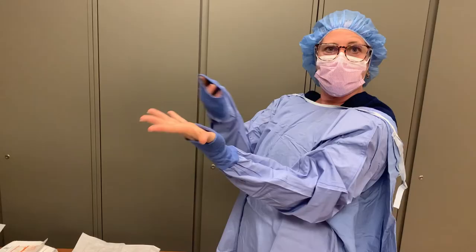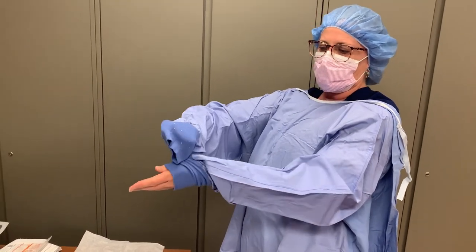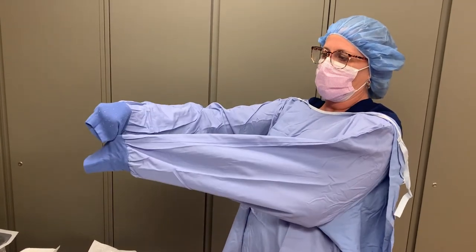If your hand does accidentally extend outside the gown, if you are careful, you may be able to sterilely slide it back in. Grabbing with the covered hand, grasp the cuff of the sleeve and carefully slide it over your hand, ensuring you do not touch any sterile outer part of the gown with your non-sterile hand. If both hands have exited the gown, this will not work and you will need new supplies to move forward.